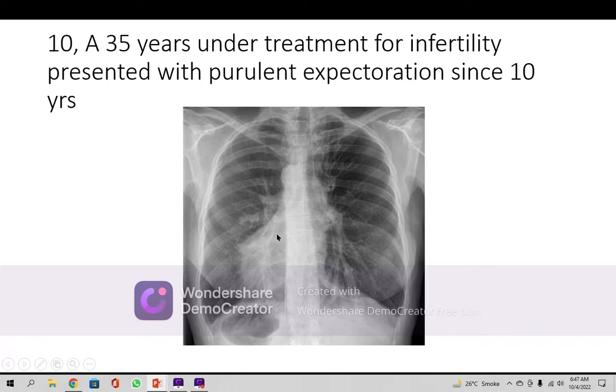And for the further investigation of this case, the important thing in Kartagener syndrome is that congenital heart disease will not be associated. The important thing is this. If it is without Kartagener, meaning it is dextrocardia only, or the axis of the heart is in the middle, that is called mesocardia. The other congenital heart abnormalities are usually seen, like ASD and VSD and patent ductus arteriosus are possibilities. But in this case, there are least chances. This is the advantage of Kartagener in comparison with dextrocardia.